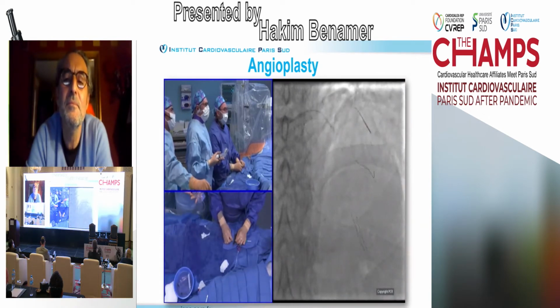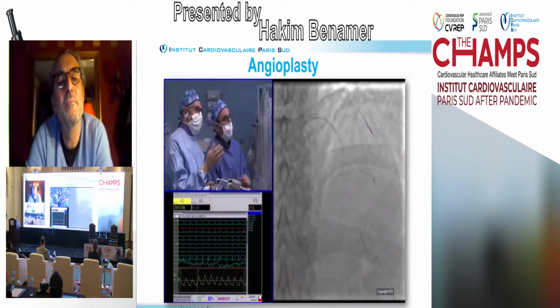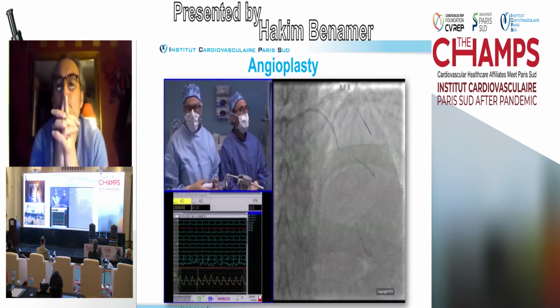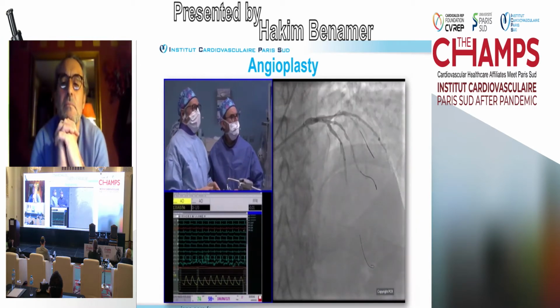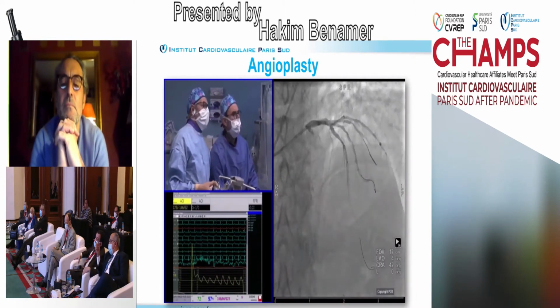I think that we are covering the middle part of the LAD. We have to check the ostium, of course. It's not necessary to go up to the ostium because there is no need. But of course, we need some space to be able to post-dilate proximally. So maybe we can do an angio at that time, check where we are exactly. Yeah, I think so.